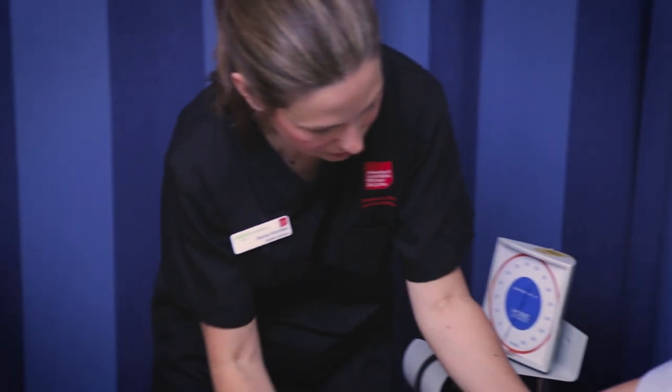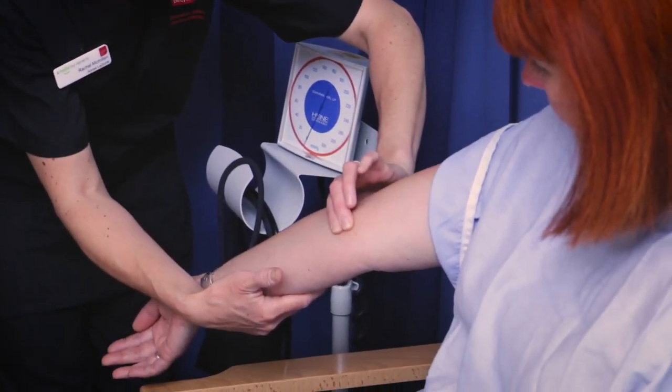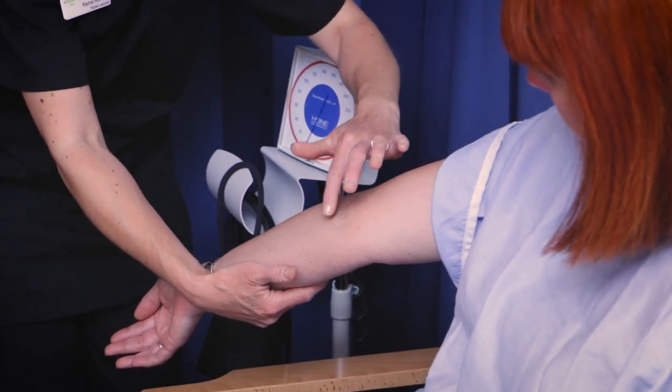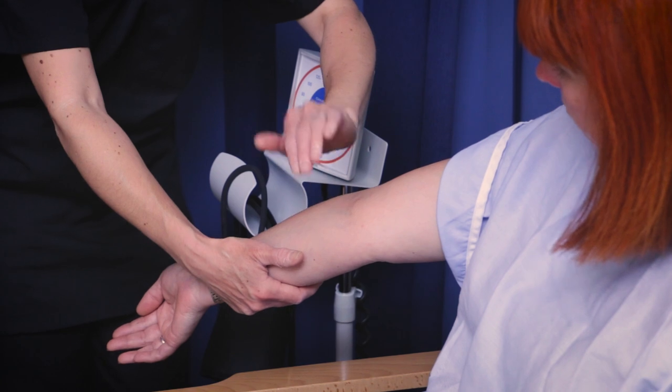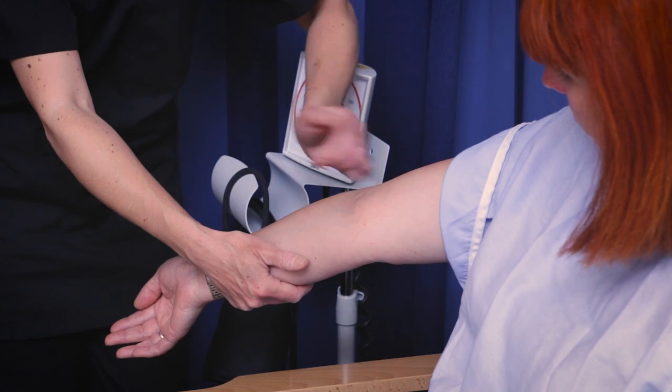So I'm going to do the same on Maria now. I can find a nice strong brachial pulse there. What I'm going to do now is make a note of roughly where I found the pulse, because that's the area where I'm going to be putting the diaphragm of the stethoscope when I listen a little bit later.